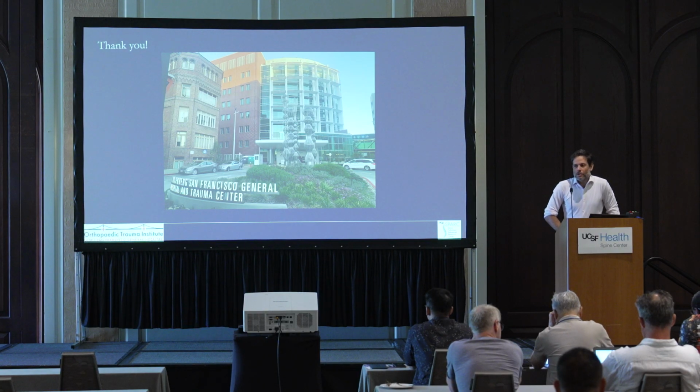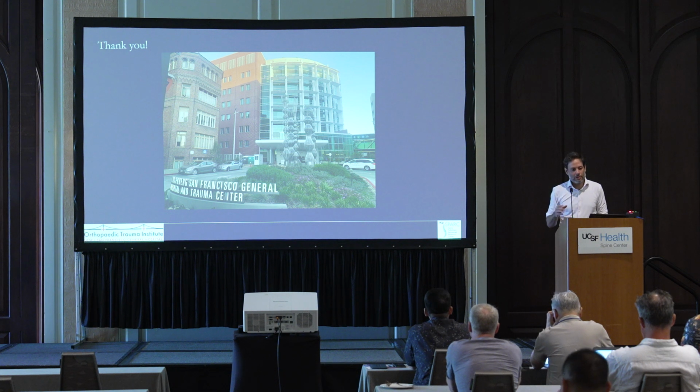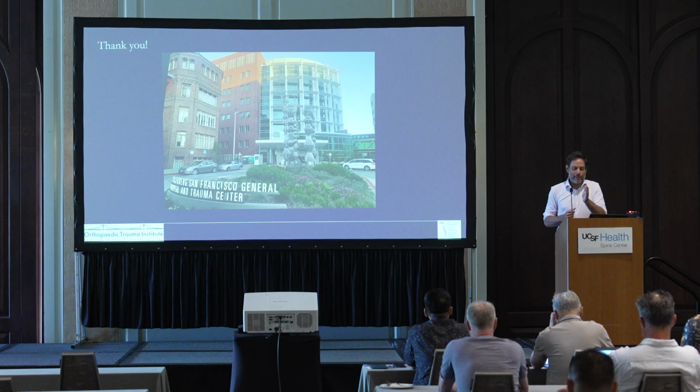Yeah. So again, you saw that one clinical picture where we focus on the bony injury, but the soft tissues are disrupted posteriorly. If you have to do an open approach posteriorly, a lot of times that fascial disruption isn't in the midline where you want your fascial incision to be. So a lot of times we'll repair that on the way in.